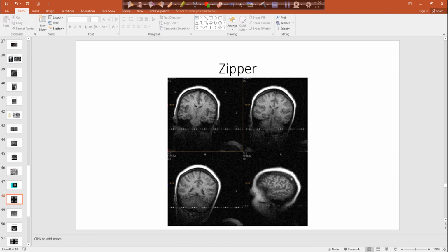So if you image it again and you change your phase and frequency direction, now this zipper artifact is streaking across our image this way after we change our frequency direction. You know that's a zipper artifact. It's nothing we can compensate for unless we find that random RF pulse energy and turn it off, eliminate it somehow.